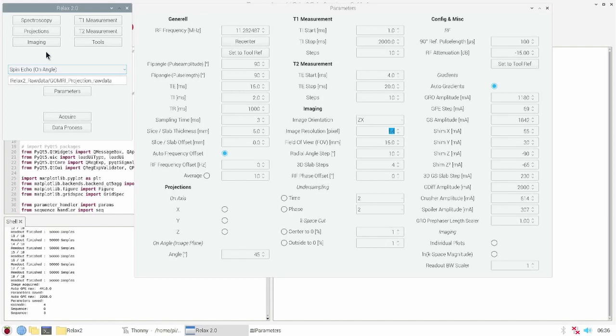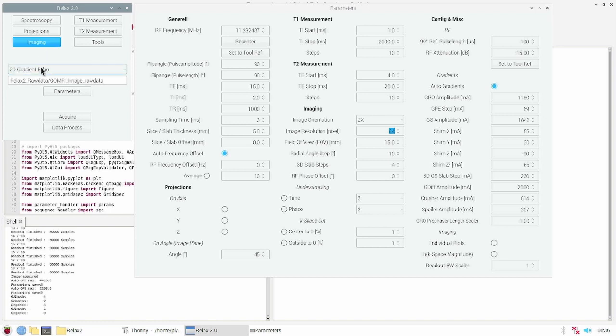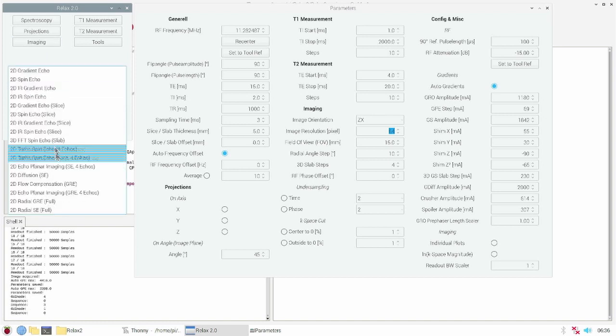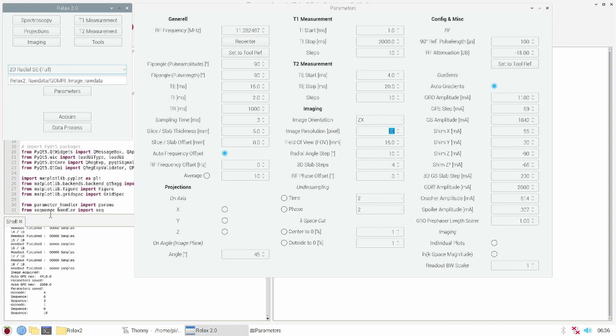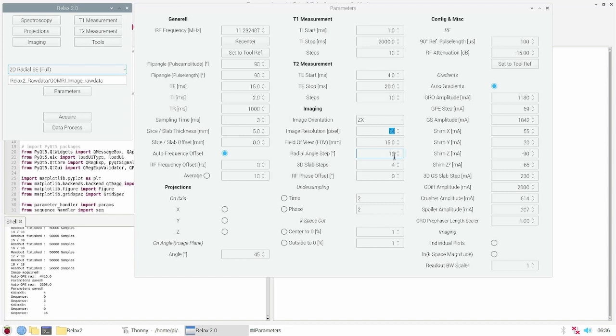Projections at an angle directly leads to radial imaging. We go to the imaging tab and select radial imaging spin echo full. We need to set the image resolution, the sampling time and the angle steps for the radial imaging acquisition. These values auto-generate the readout gradient amplitude.